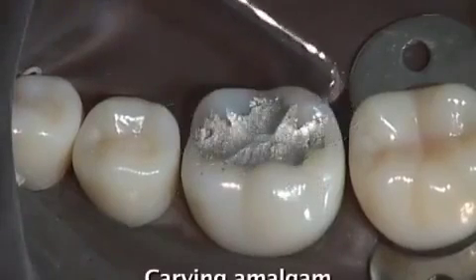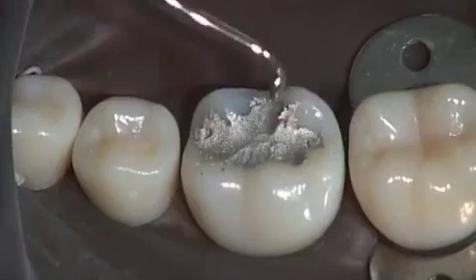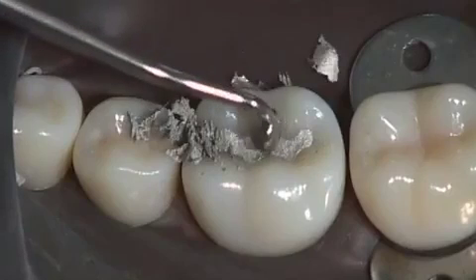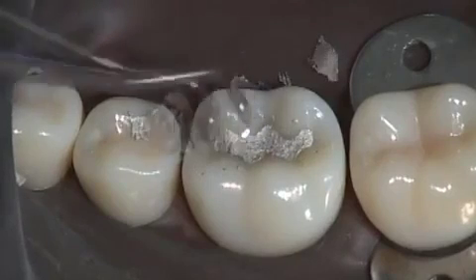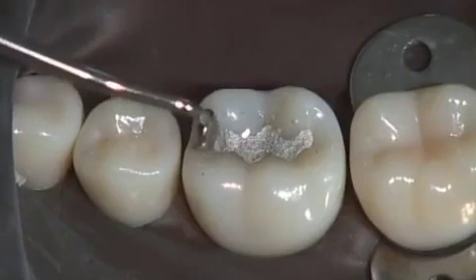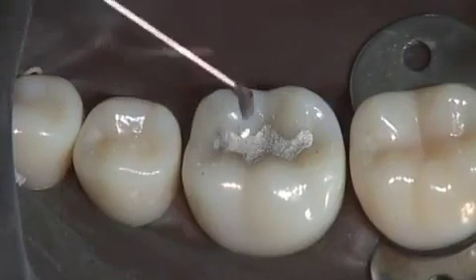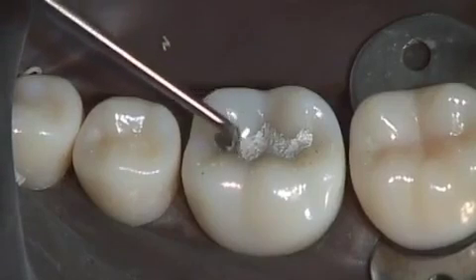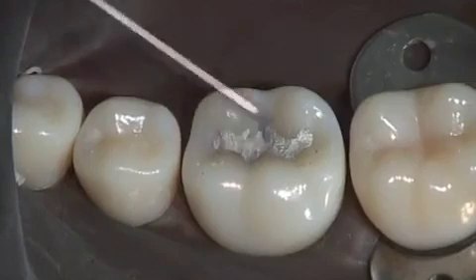With a cleoid discoid instrument, you can begin to develop the anatomy of the final restoration. Always make sure that part of the instrument is on the tooth surface and part is on the amalgam. Move the working end of the instrument parallel to the cavo surface margin. The carving process should take place during the onset of the amalgam setting.